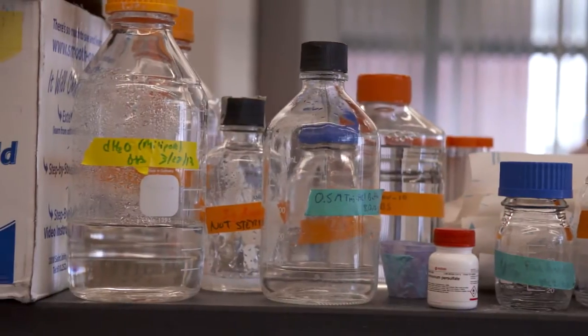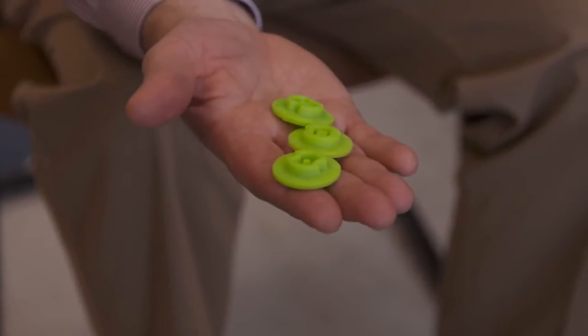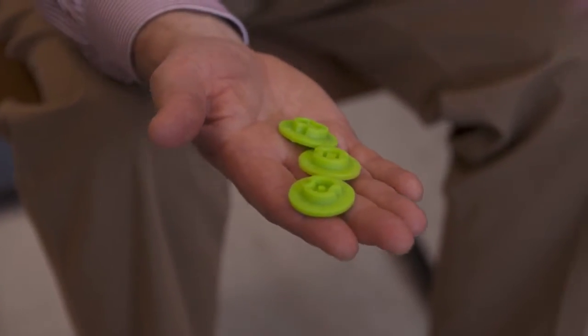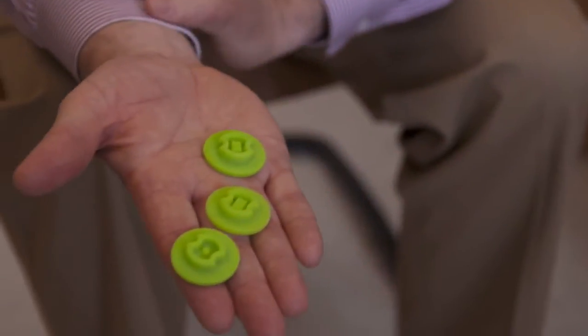This past year we just signed a deal with a major global distributor of scientific products, Sigma Aldrich. And so now the Petri dish, which was invented in Rhode Island, manufactured in Rhode Island, is actually sold all over the world.